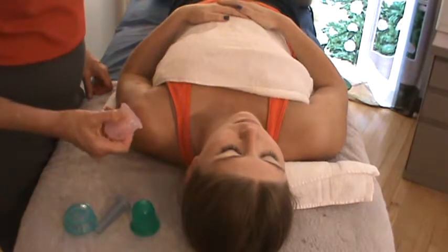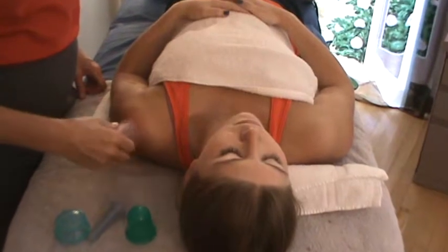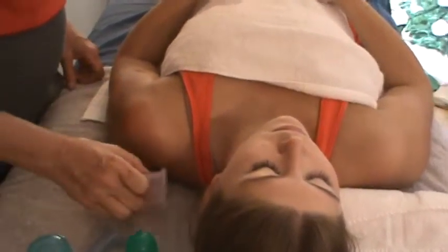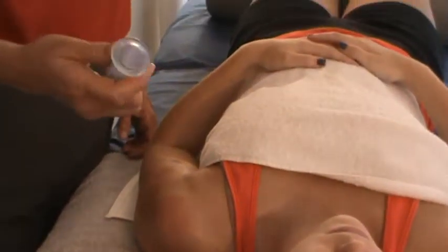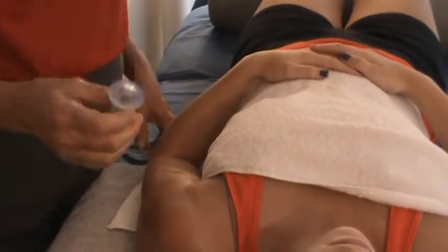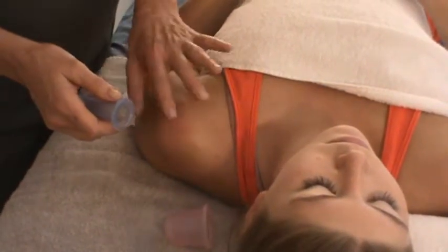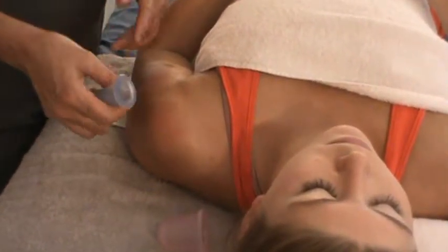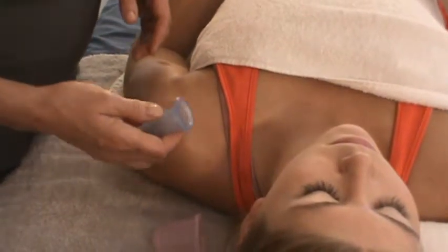Now, using the cups, choose a cup size that fits the area that you're going to be working on. So here we'll be looking at the shoulder girdle. For someone with a finer body type, you're probably going to use a smaller cup. And with these silicone cups, I have the patient pre-lubricated. I've massaged through her entire shoulder girdle complex with coconut oil, which gives you a superior glide when working with gliding cups for fascial release.